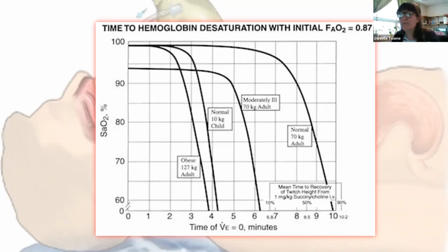It really depends on the patient, the situation, their disease process. So just talk with the provider: what SpO2, what number do you want me to let you know you've reached during your intubation attempt, so that you can decide if you're going to stop the attempt to bag the patient back up again. And again, we're trying to avoid all of this by doing really good pre-oxygenation.